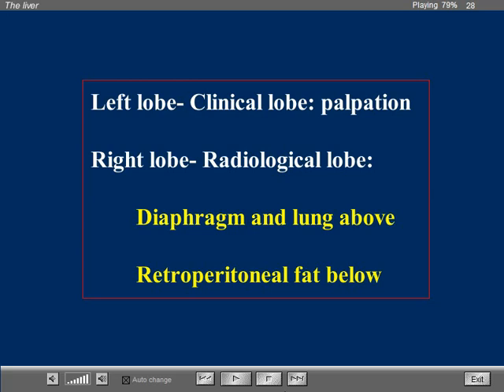So radiographically, one can characterize hepatomegaly involving the right lobe better than the clinician, who only can feel the liver extending below the right rib cage, and by percussion the increased dullness of the right upper quadrant when the right lobe enlarges. So it is easily depicted, the hepatomegaly of the right lobe, by radiographic technique, chest and abdominal studies, and clinically the left lobe is easier to detect by clinical examination than by radiographic techniques.